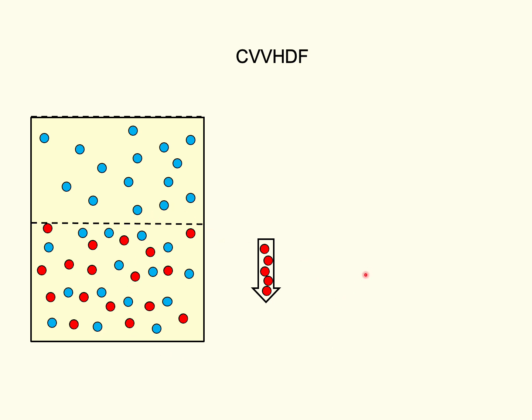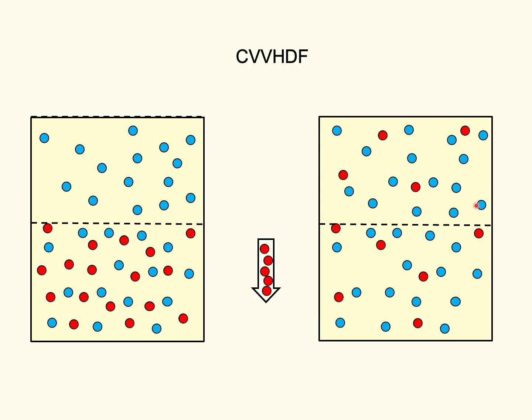In other words, toxins are lost by 2 mechanisms with this modality. 1, ultrafiltration and convection of large amounts of plasma water and replacement with toxin-free dialysate, and 2, diffusion of molecules down their concentration gradient into the dialysate, resulting in a double whammy decrease in unwanted solutes. Thus, ultimately, plasma composition and volume can be altered by a combination of ultrafiltration, convection, replacement, and diffusion.